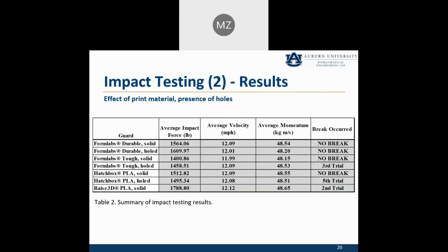Again, that's not too surprising, because when you introduce the holes, you introduce these stress concentrations. The Hatchbox brand PLA solid version did not break. The holed version broke in the fifth trial, and the Raise 3D solid version, interestingly, broke on the second trial.